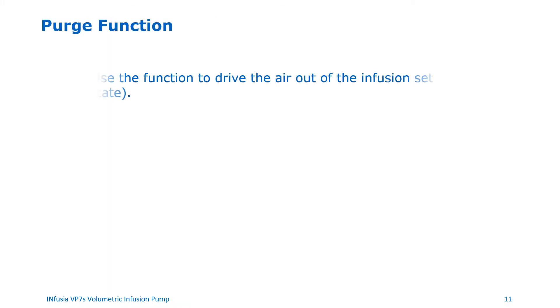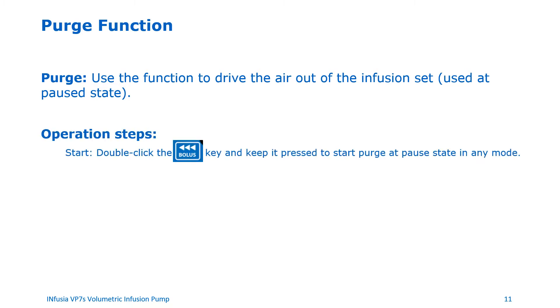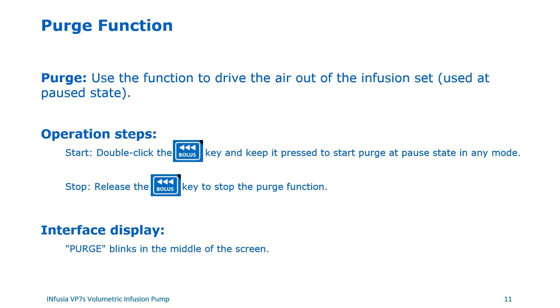Purge function. You can use the purge function to drive the air out of the infusion set. The purge function can be used in any mode. To start the purge function, double-click the bolus key and keep the button pressed. To stop the purge function, simply release the bolus key. When the purge function is on, the word 'purge' blinks in the middle of the screen.